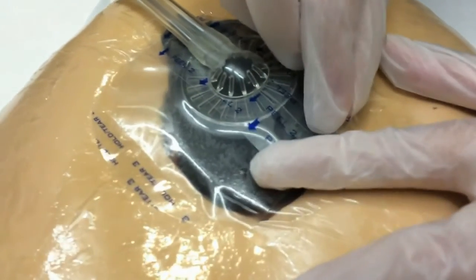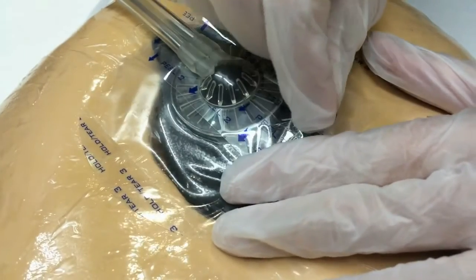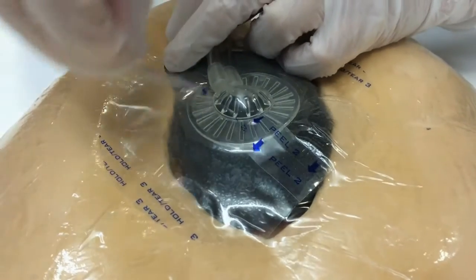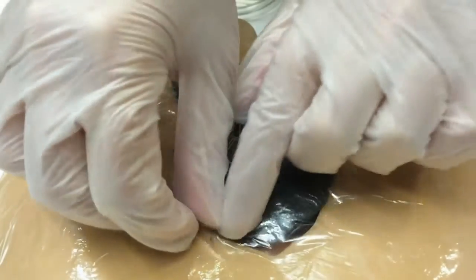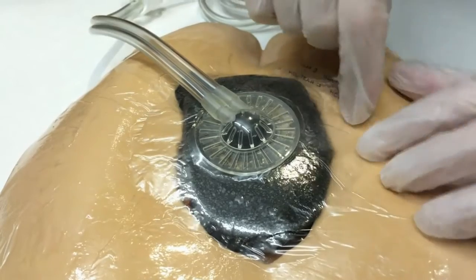Then we're going to grab our number two, and as you can tell, the arrows are coming this way, so it's just lift and remove on that side, and lift and remove on that side — easy as one, two, three. And these number threes, all this is is a tear, so we take our number threes off.